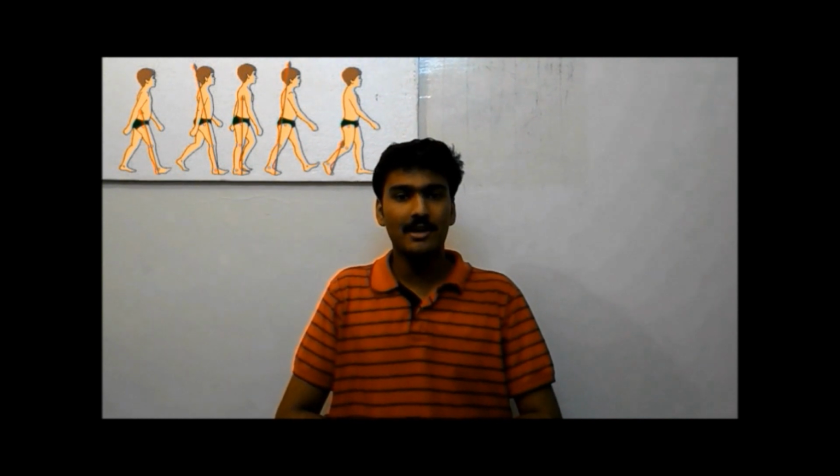We studied the normal walking gait of a human being. Normally, while walking, 70% of the weight is shifted alternately from one foot to the other. The forward motion of the leg in the swing phase begins when 70% of the body weight is shifted on the other. Therefore, it is important to detect this point at which the knee joint is to be actuated.